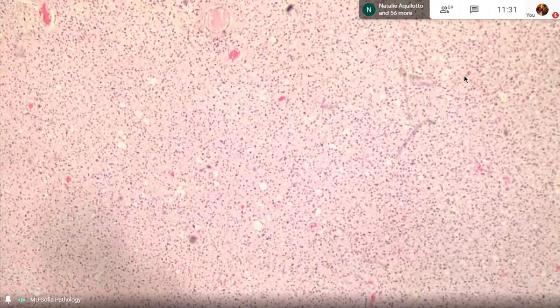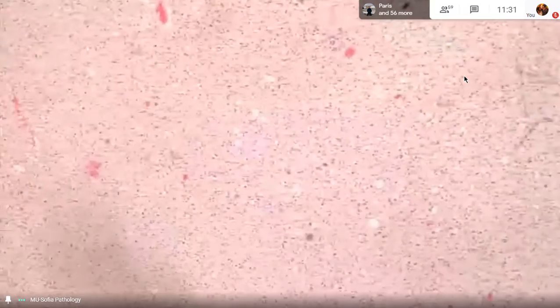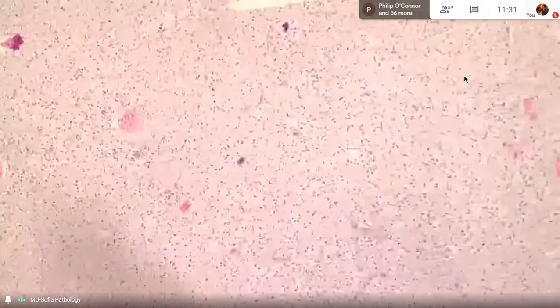No, they are not. You have just one nucleus for the fatty cells, if they are normal. This is a microcyst, which is a specific histology finding in the astrocytoma, so it's not a problem. Just carefully read what you see.